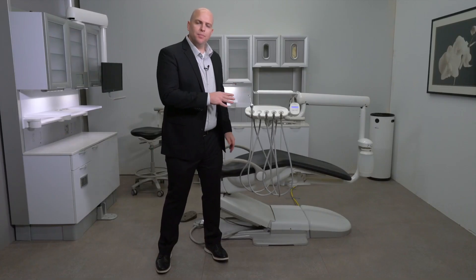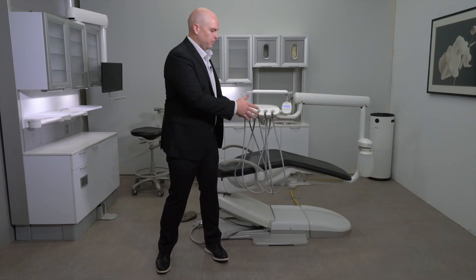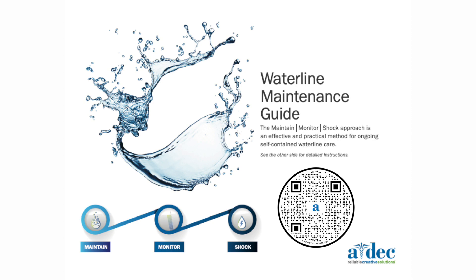Before we start discussing the delivery system, let's first talk about the water bottle. I want to refer you to the waterline maintenance flyer that can be found online.